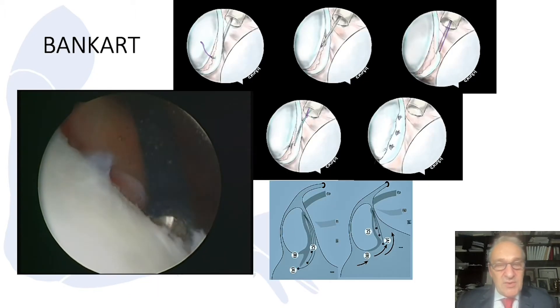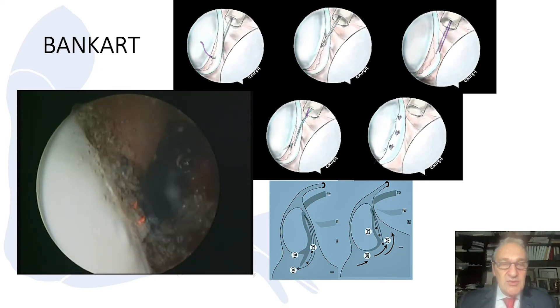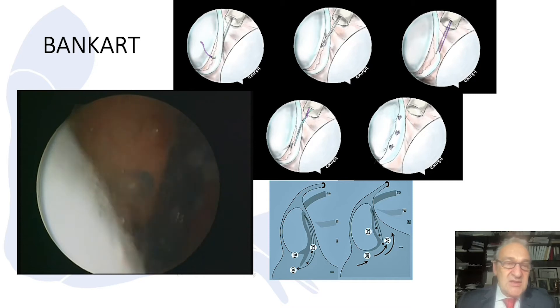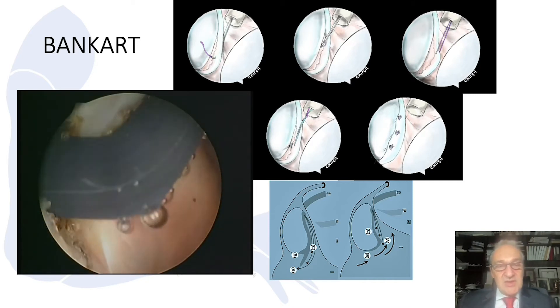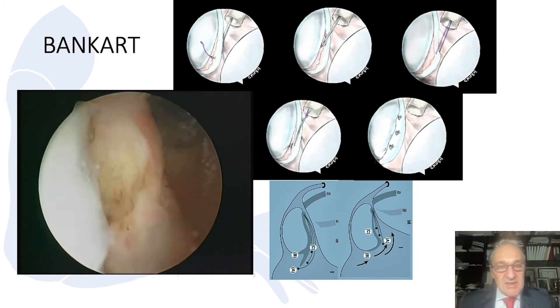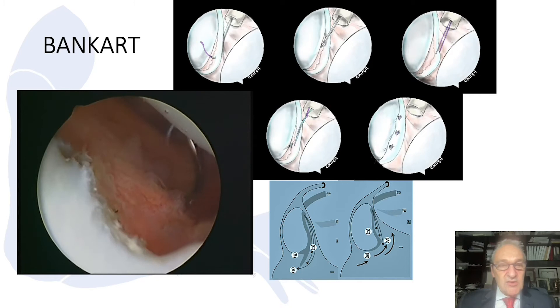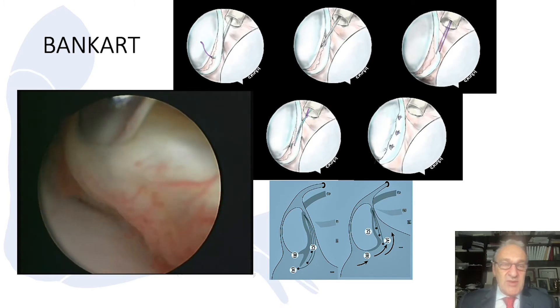In the Bankart lesion, when we visualize the joint, we can see the labrum and the capsule. In this joint, you can hardly see any labrum. The ligamentous complex has shifted medially and is elongated and lax. So we try to reattach this labral complex.